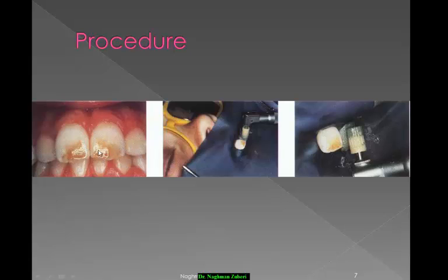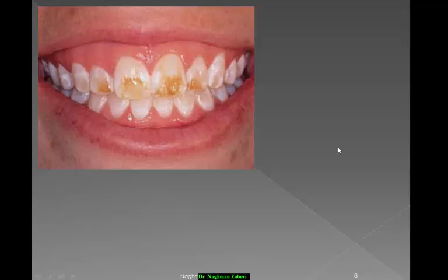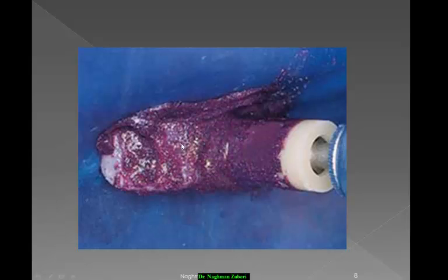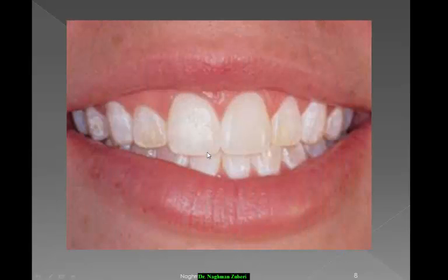Here you can see a case with moderate fluorosis. After taking informed consent and isolating the teeth, the commercially available compound tested for this purpose is used. Check out the preoperative appearance — the procedure is being performed on the isolated teeth with the enamel defect. This is the postoperative result, and this is the postoperative smile of that same person. Those superficial marks that were not aesthetically pleasing are gone, and a calm, beautiful smile is produced and maintained.